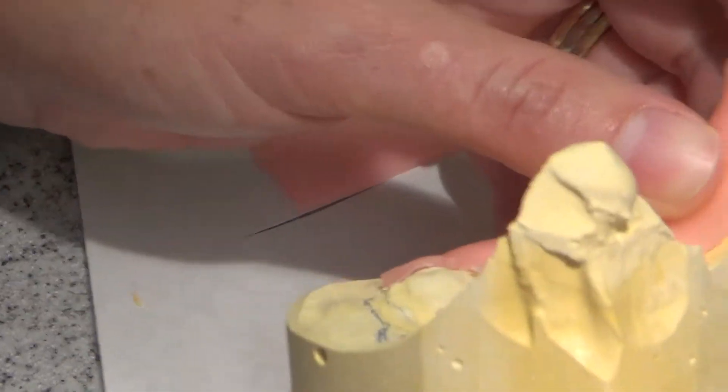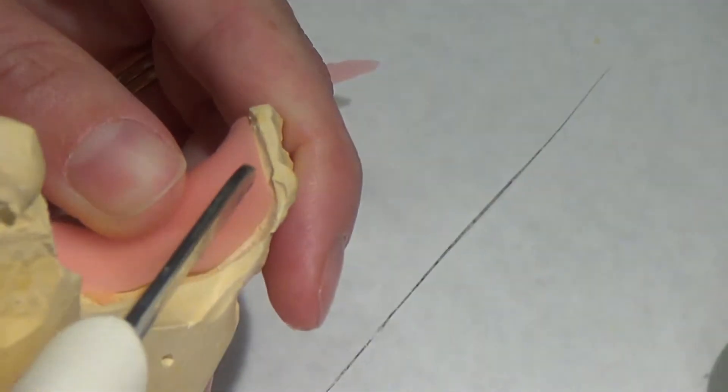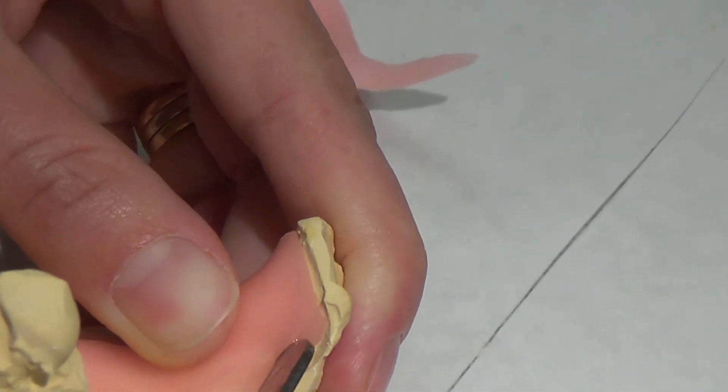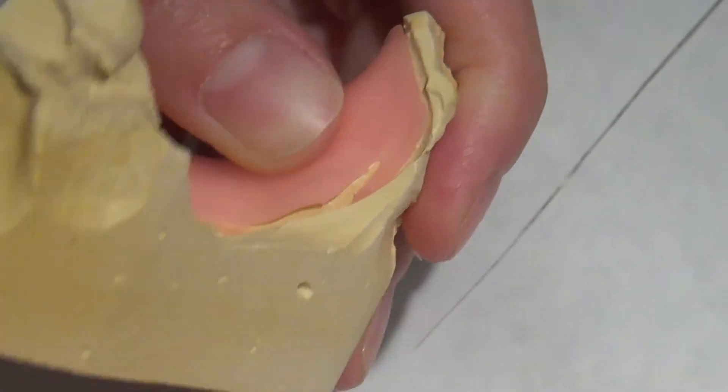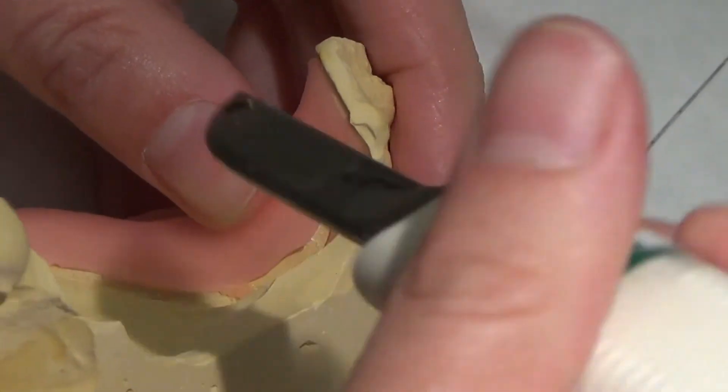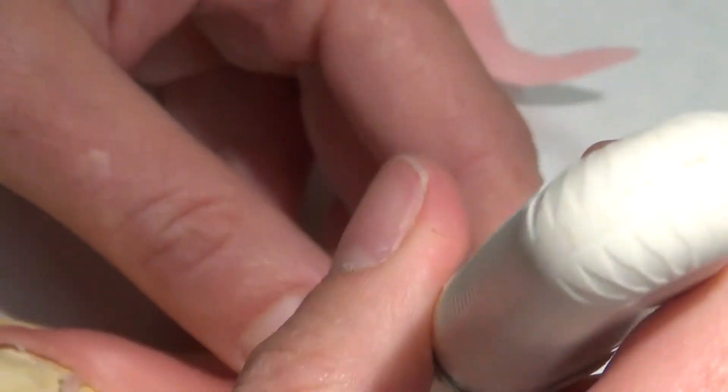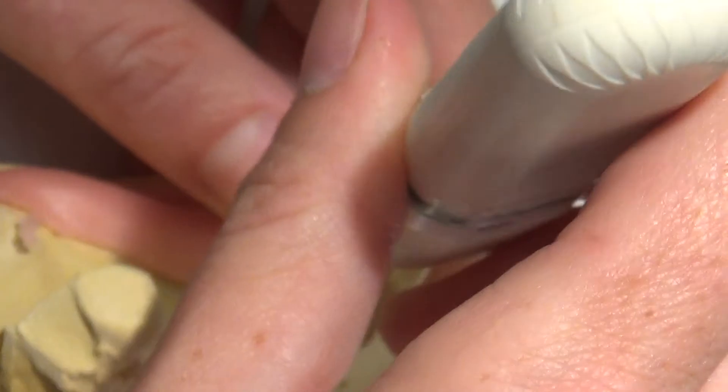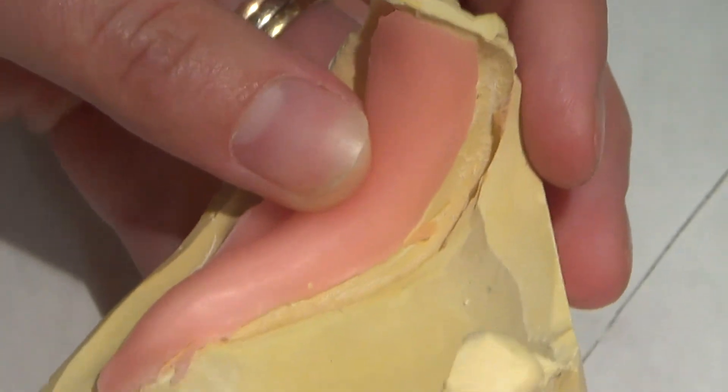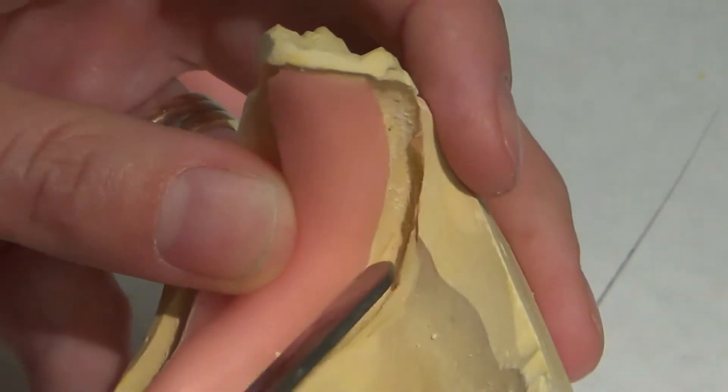This one, she's got quite a few challenges for me to overcome. Thickness of this denture, for one, is going to be an issue. She doesn't have a whole lot of anatomy for me to grab onto. She has pretty low expectations. She's been wearing dentures for many years that are poorly fitting dentures, and she gets along with them okay.